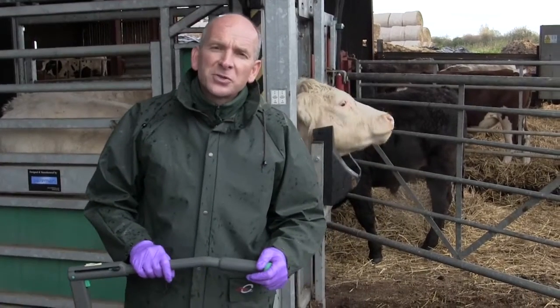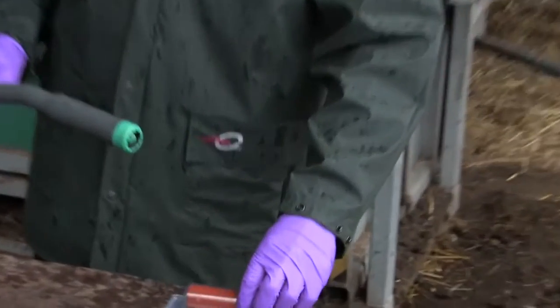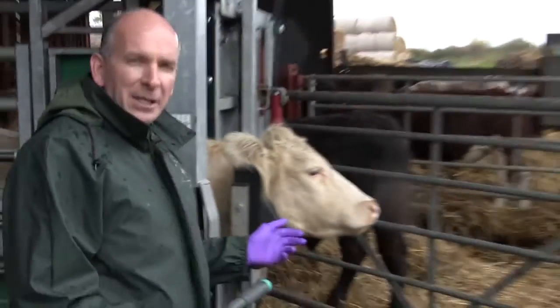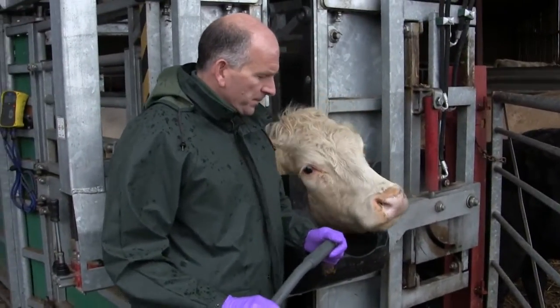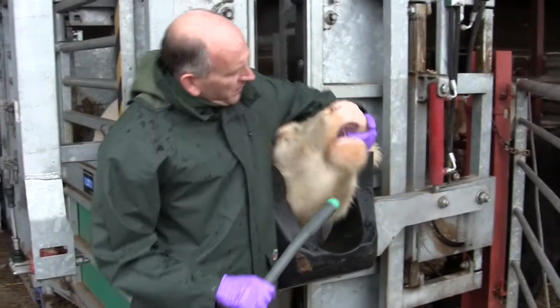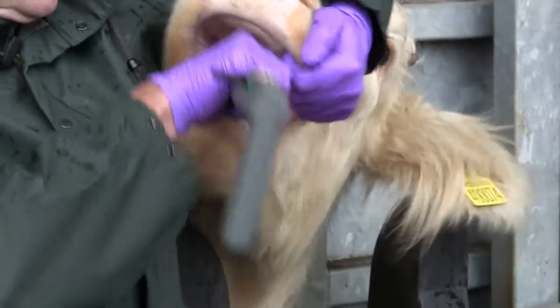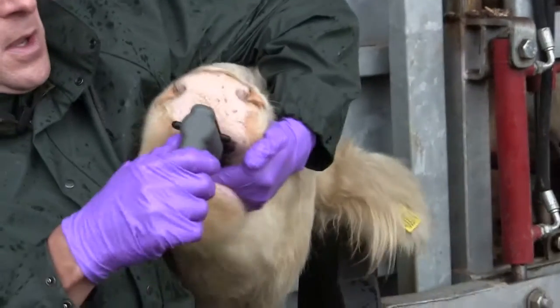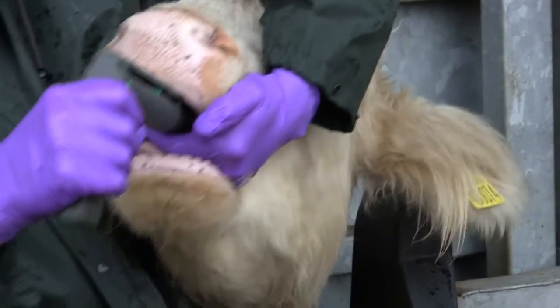We're now going to demonstrate the administration of a bolus. Get your gun and load it with the bolus that you're going to use. The animal should be adequately restrained so that the bolus can be administered safely. Introduce the bolus gun into the front of the animal's mouth and push it gently but firmly down over the back of the tongue to the back of the mouth, lifting the head as you do so. Once you feel that the bolus gun is in the correct position, the bolus can be administered by squeezing the release trigger.